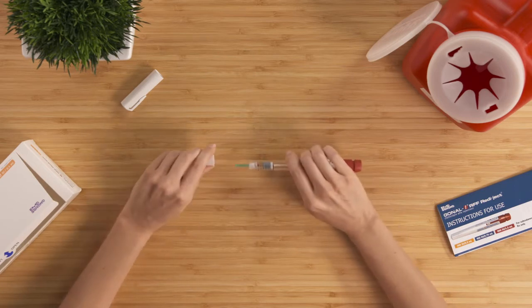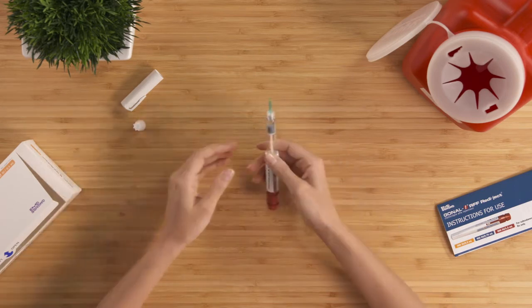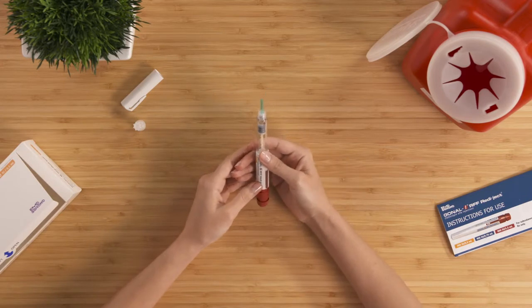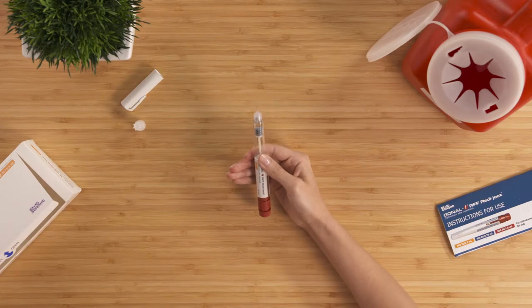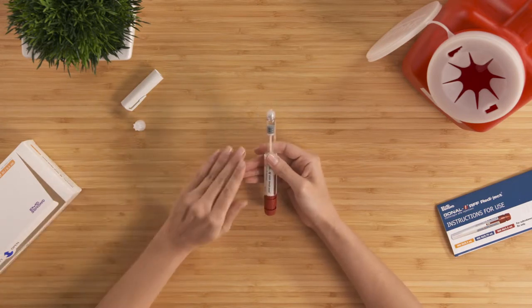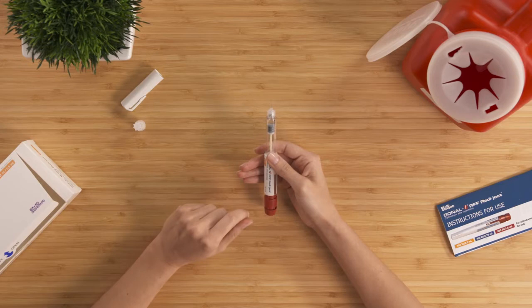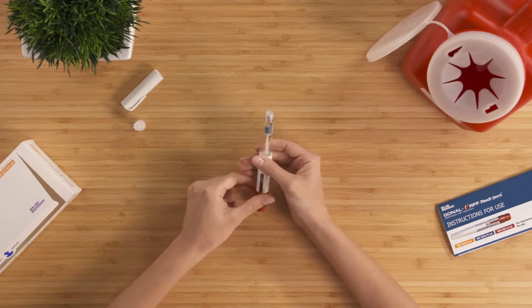Pull off the outer needle cap and save it for removing the needle after the injection. Keeping the needle pointing up, carefully pull off the green inner needle shield and throw it away. Lastly, a warning. Do not recap the needle with the green inner needle shield. You could stick yourself with the needle.